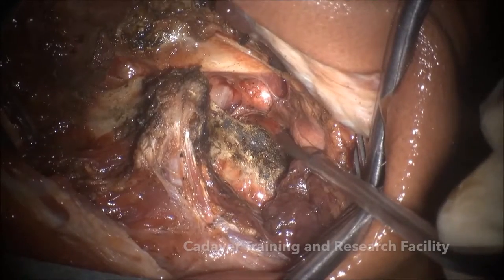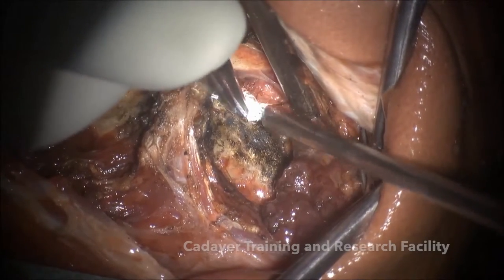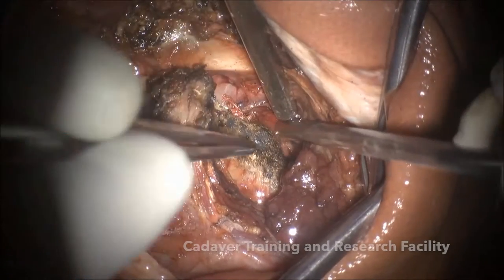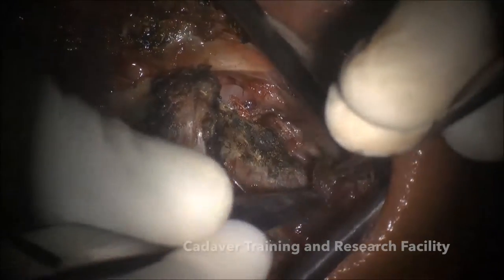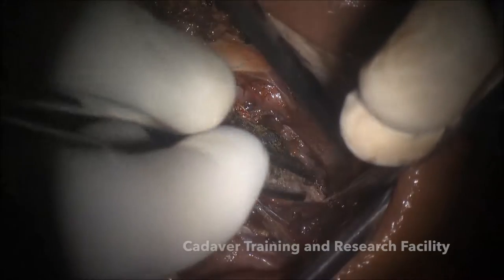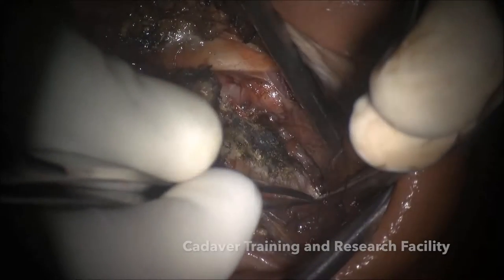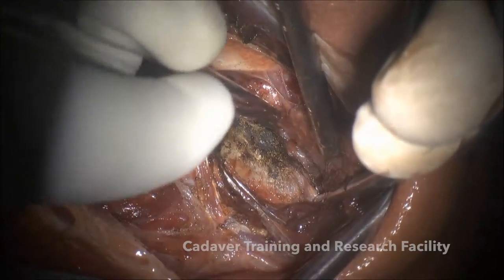To control this epidural bleeding, you have to take a dry gel foam and push it into the epidural space like this. The second point of bleeding is lateral — if you pass the monopolar more laterally it will bleed. So you should not go too lateral, but you can always put some gel foam there. All you have to do is follow the upper border of the C2 lamina.